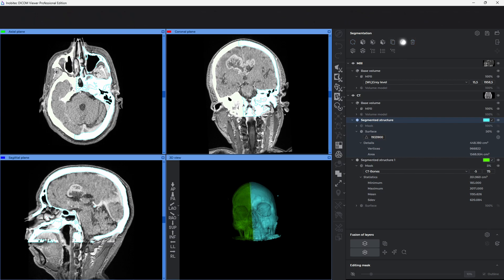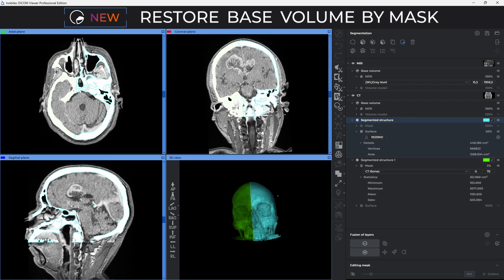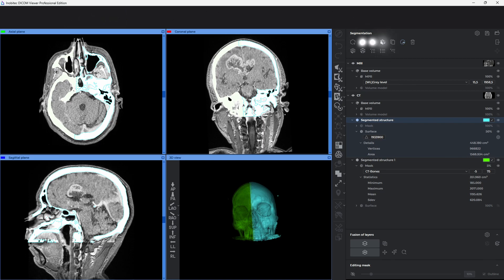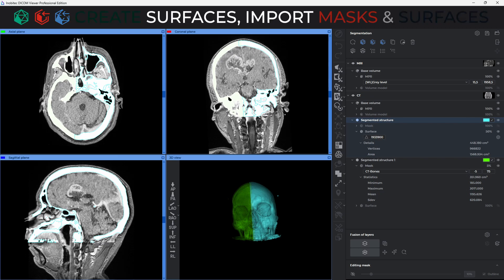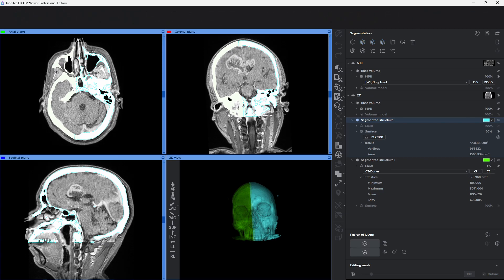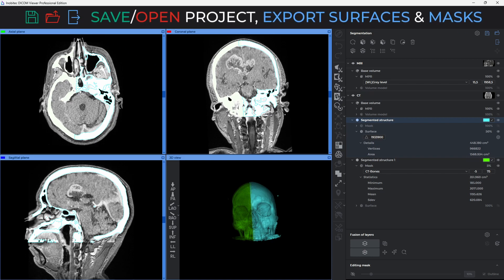The new tool Restore Base Volume by Mask transforms the base volume to the form of the selected structure's mask. Controls of the segmented structures have been moved to the upper part of the panel together with data import. The buttons for saving and opening a project as well as exporting data have become more user-friendly and are now separated from the structure's main toolbar.